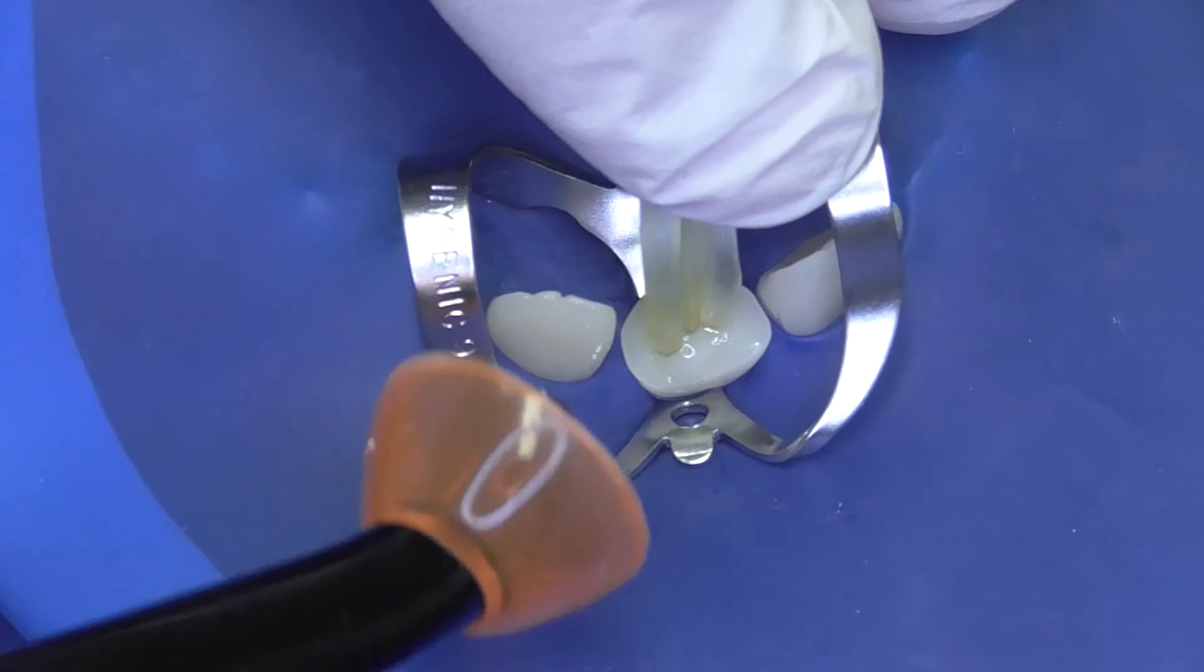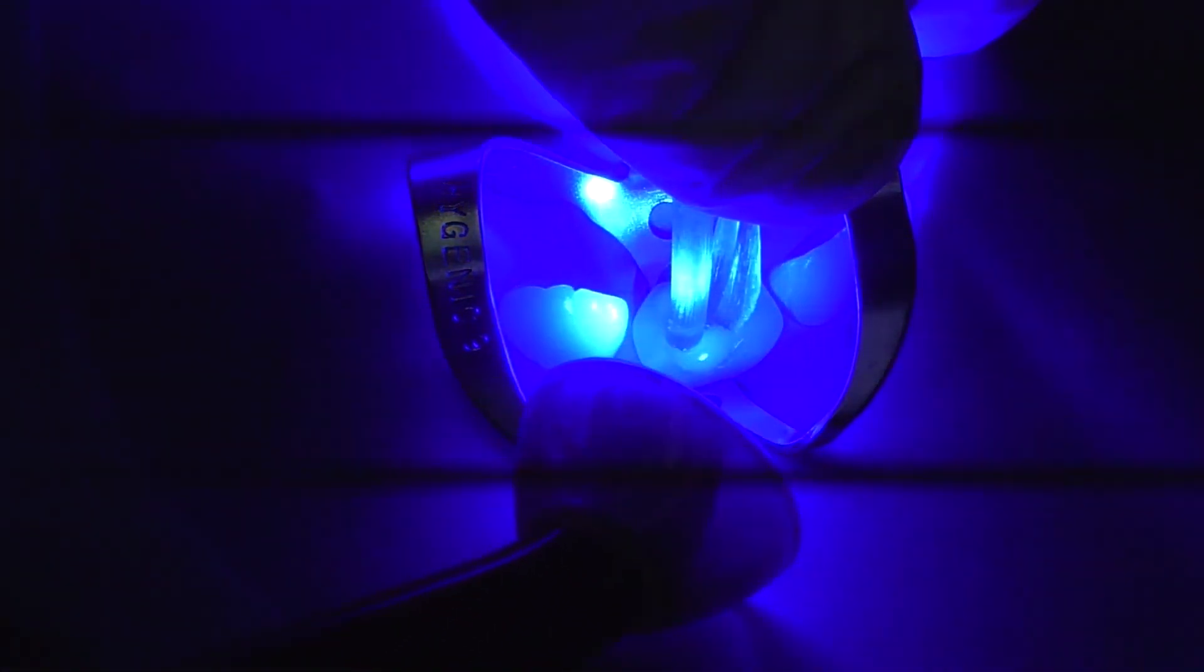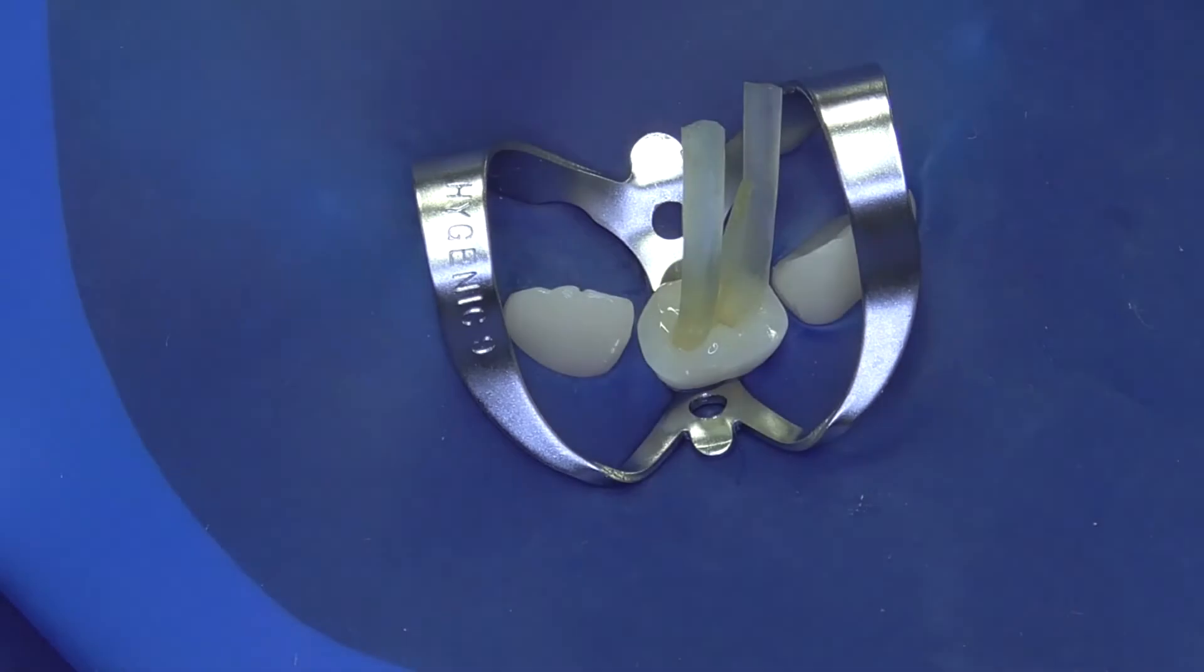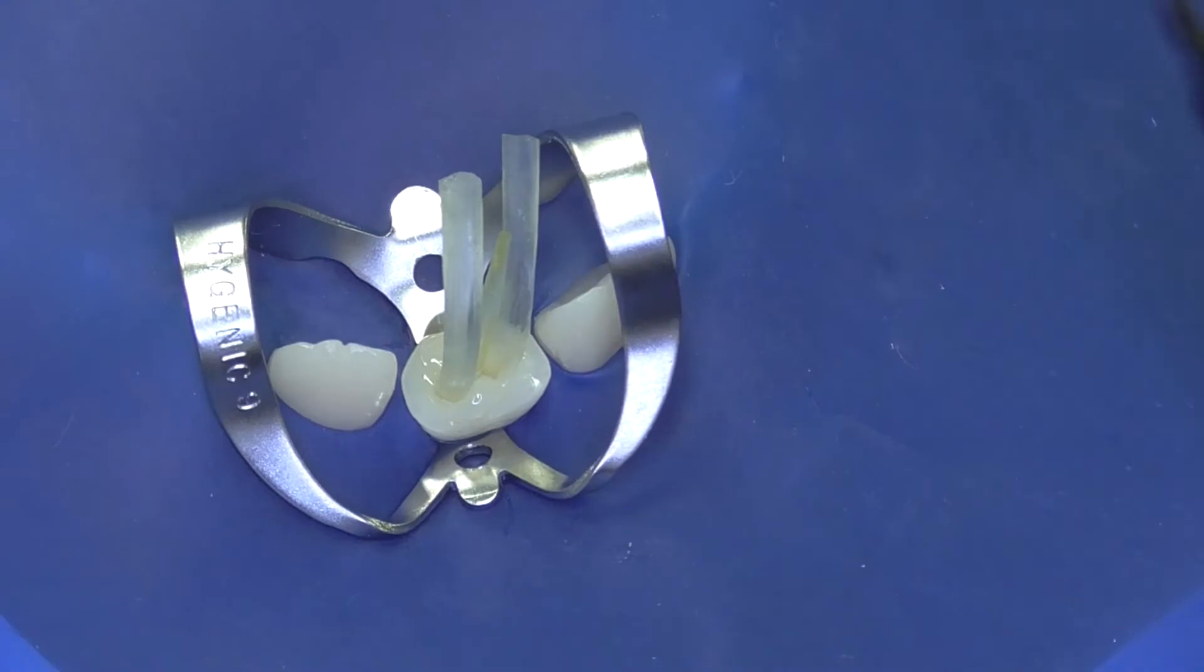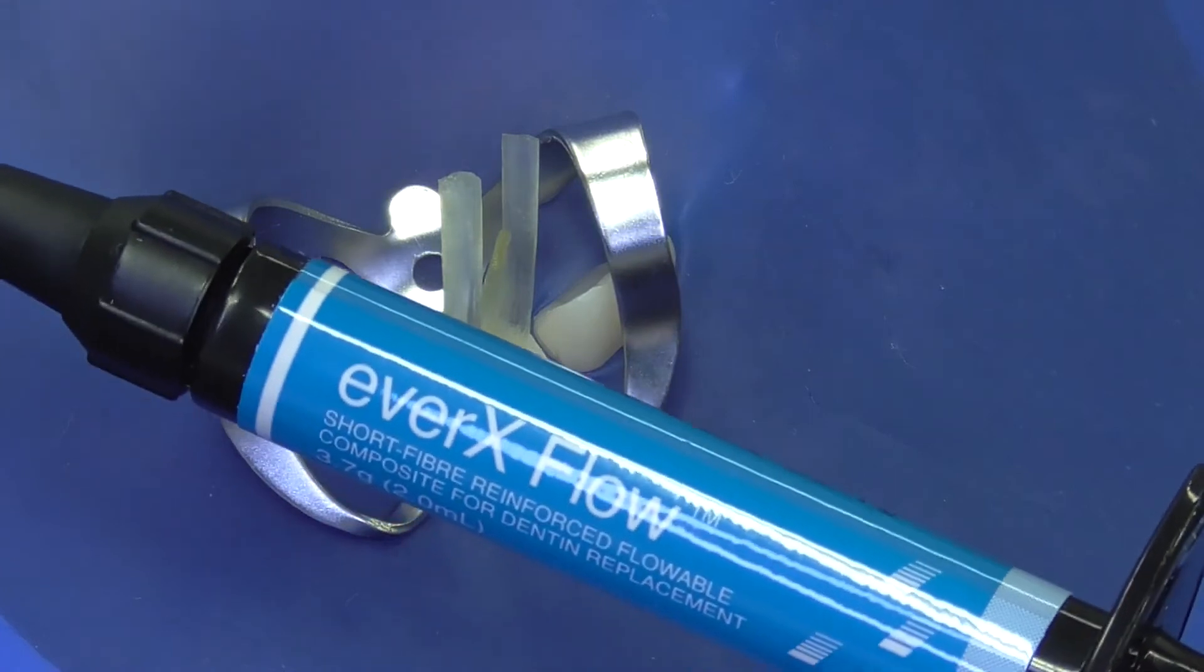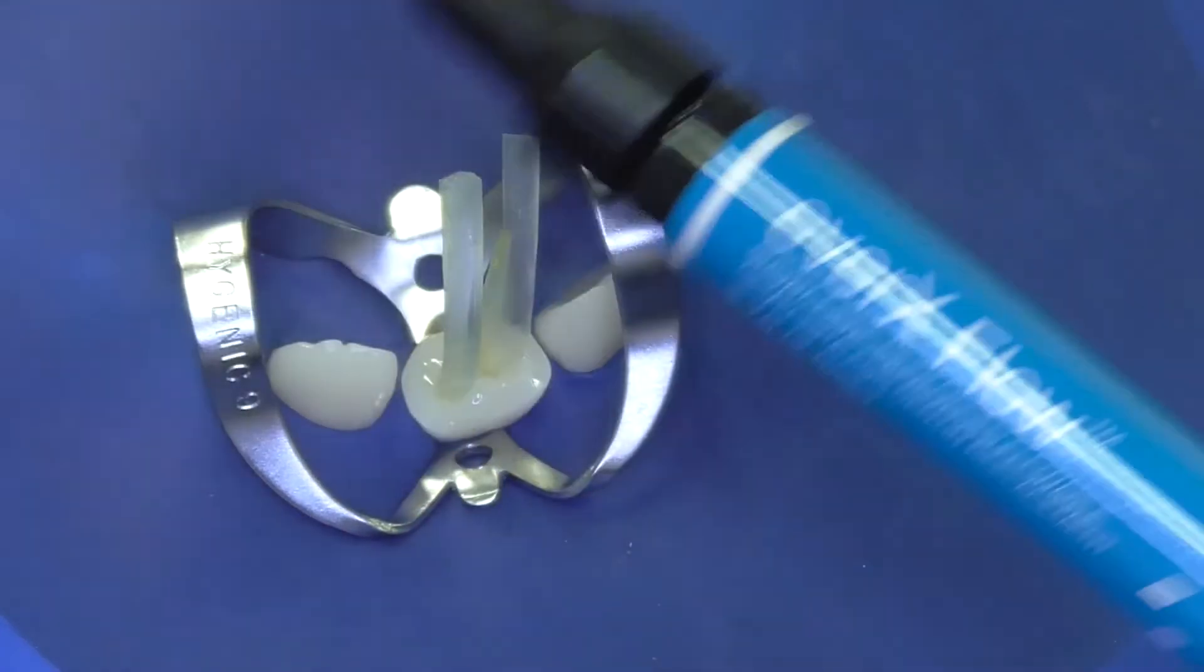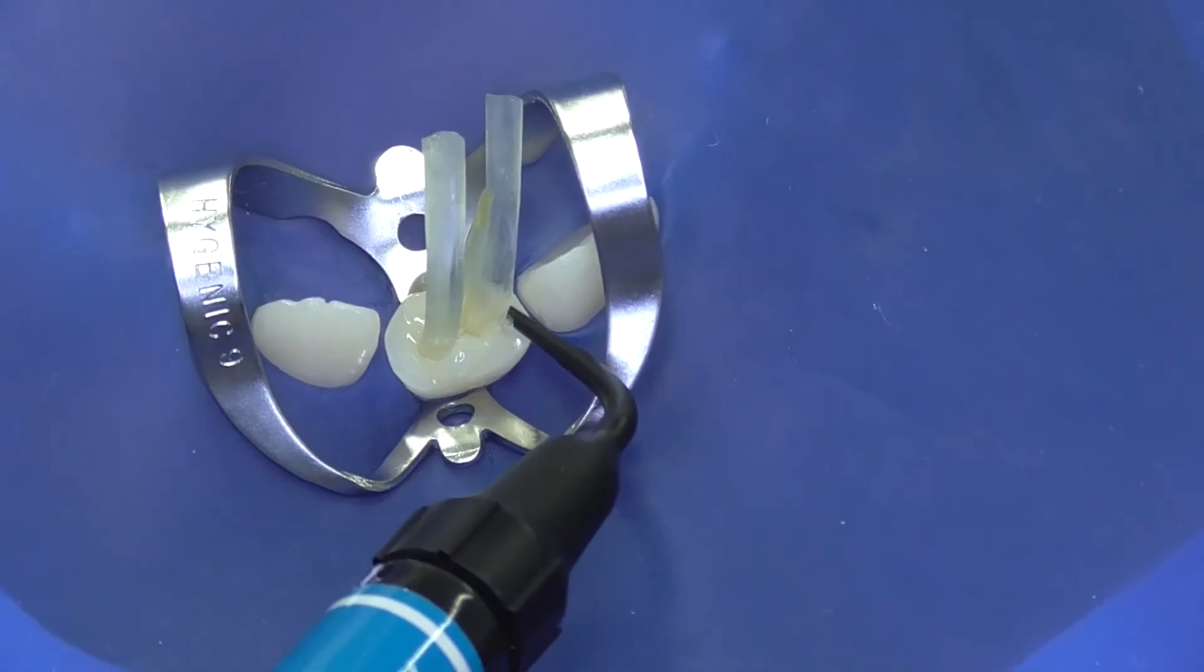Final curing of the post with the light transmitting through the fiber post will be made after cutting the fiber ends. The actual core in this case will be made out of reinforced composite material, short fiber reinforced EverX Flow.